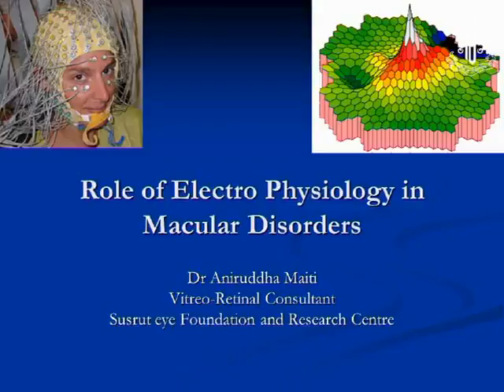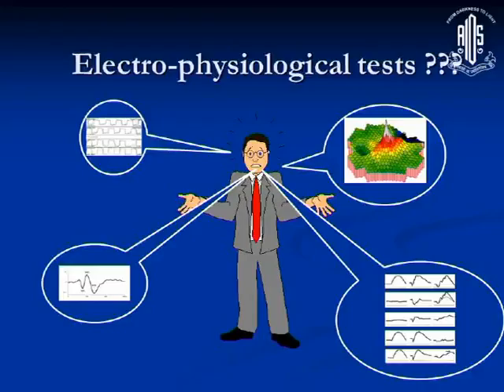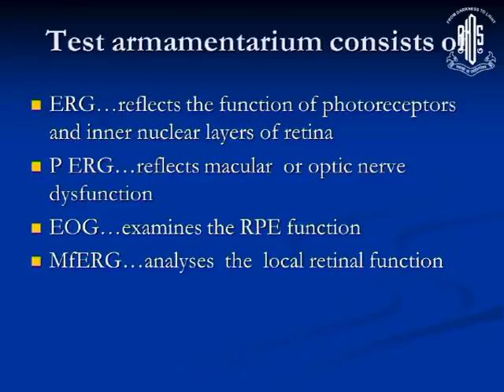I will be speaking on the role of electrophysiology in macular disorder. Electrophysiological tests are confusing. We are not very sure what test to advise in which conditions. There is a test armamentarium which consists of ERG, pattern ERG, EOG, and multifocal ERG.